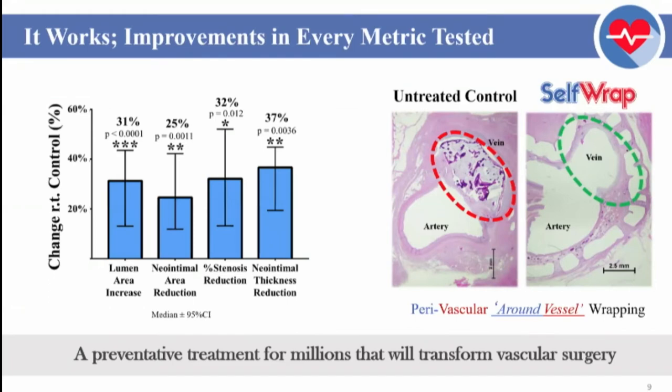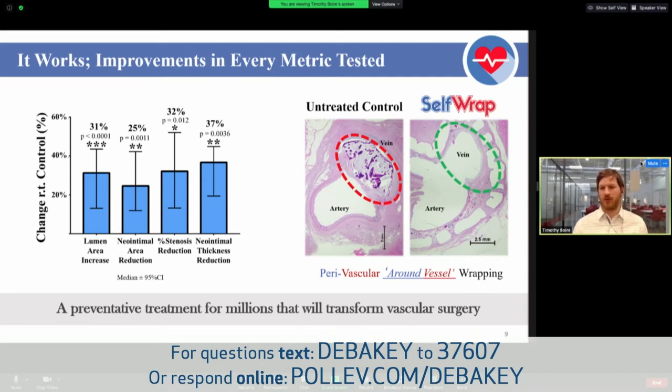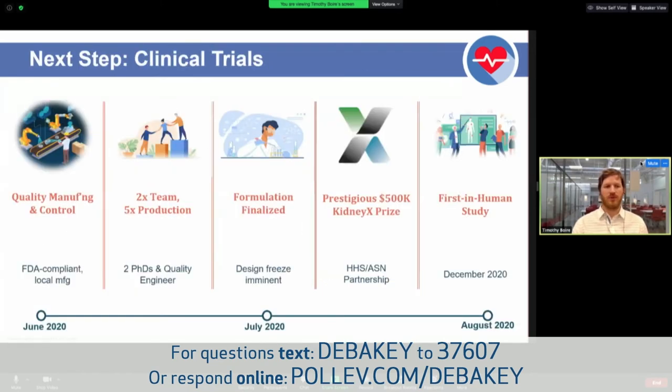We were also able to secure some funding to do a survival study out to 3 months at American Preclinical Services in Minneapolis, which is part of this NSF Phase 2 grant where we have a subaward with Houston Methodist. The feedback on our design from Dr. Peden has been extremely helpful as we gear up for a GLP sheep study. This study showed proof of concept: we saw significant reductions in neointimal hyperplasia, the main culprit of these failures, as well as significant expansion of the lumen around the vein and anastomosis regions based on the histology. This told us that our device and technology is actually working, and that's why we're completing all our biocompatibility testing now to do a first-in-human trial and do our GLP study somewhat in parallel, probably pushed out more to January of next year.